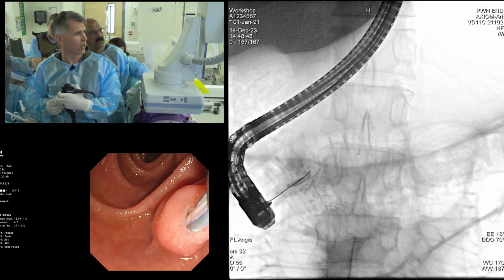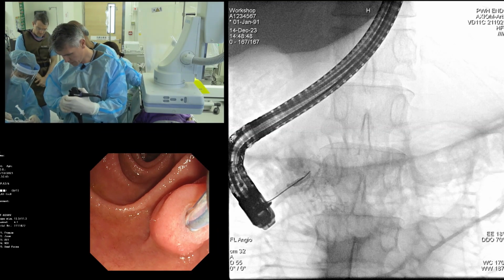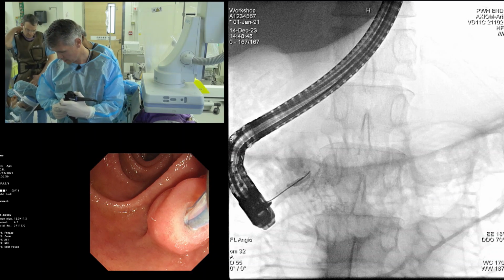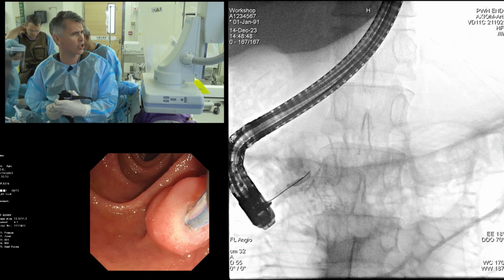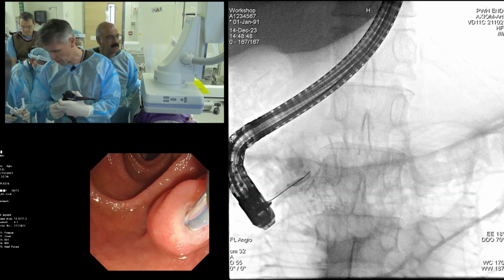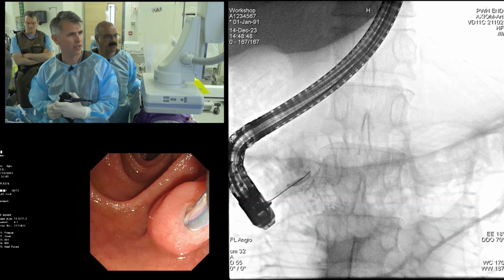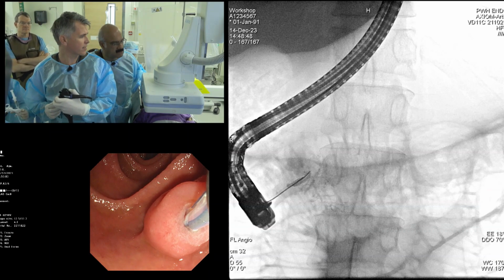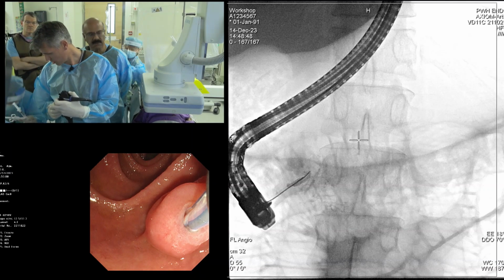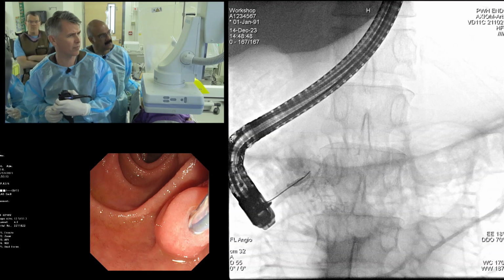Here we are using the Olympus ESG 300 electrosurgical unit. So we connect here, and we then choose an alternate cutting with less coagulation with an effect of 2. So you'd use a different cutting compared to the bile duct? Less coagulation here. Some people use pure cutting, but I think it is a good idea to have at least some coagulation.